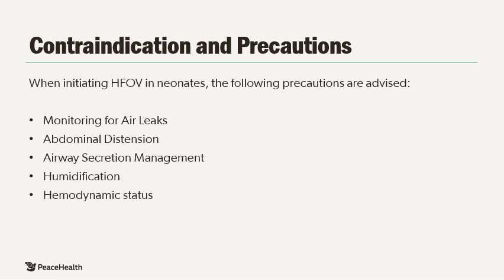Increased airway secretions can occur during ventilation, potentially leading to airway obstruction. Regular suctioning and ensuring adequate humidification of inspired gases are important to maintain airway patency. The patient should also be hemodynamically stable. If not, consider optimization of hemodynamic status prior to initiation.